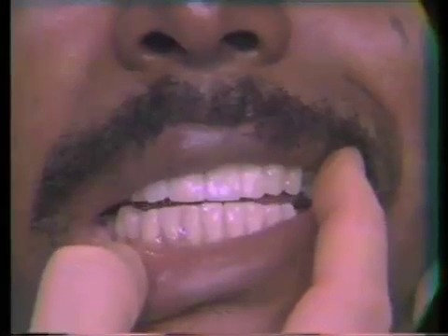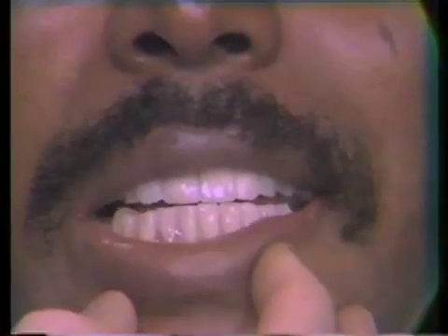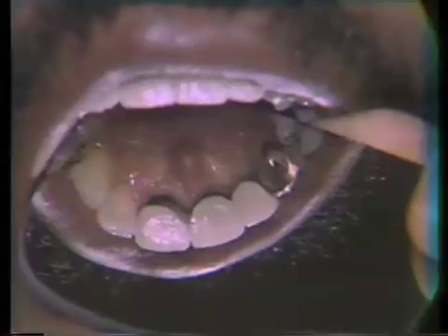Now I'd like to show you the bridge on the patient. The patient has been wearing this bridge for several months. You'll note the absence of display of gold on the cuspid on the pin ledge, and you'll note also that we have opened just a little of the existing teeth to make this bridge blend in. I'd also like to show you the lingual surface — you'll note the amount of gold that we have on the incisal edge of the cuspid, and yet the lack of display of gold when you look at it from the labial.